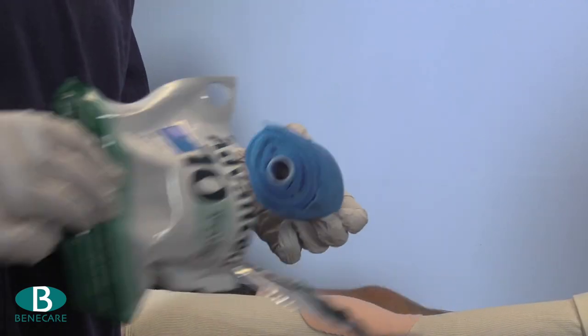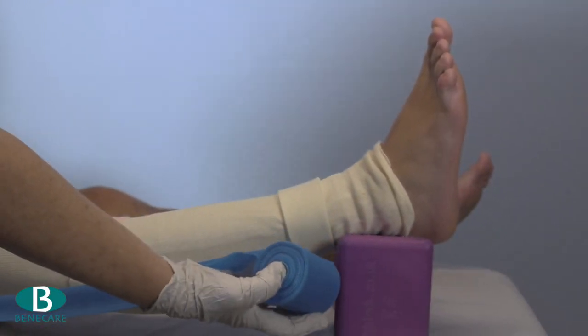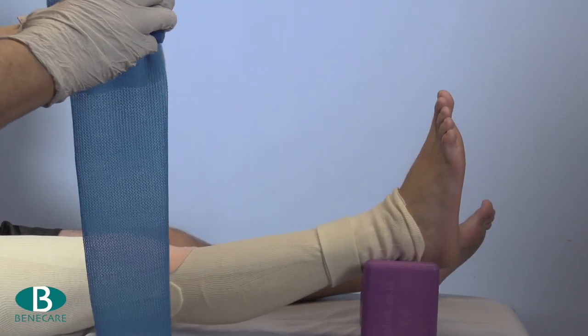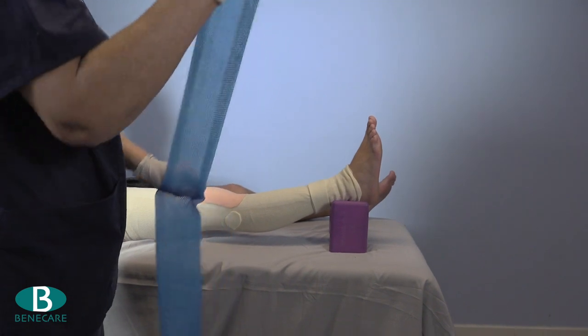Apply your gloves and then, using Benecare Advanced 10cm, make a two-layer slab to fit along the posterior aspect of the leg and cut this off.